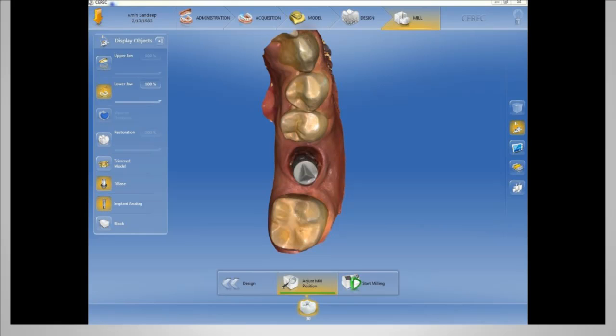At this stage, we acquire our images. We can acquire an optical impression of the lower arch, as you see here, for tooth number 4-6 or tooth number 30 here in the United States. You can see the gray scan body. You can see a hint of the notch that's on the scan body lined up with the scan post. You can see the anatomy of the gingiva and the gingival cuff heights. You can see the proximal contacts and the surfaces of the adjacent dentition. Okay. Once the image has been acquired, we can actually select Next.